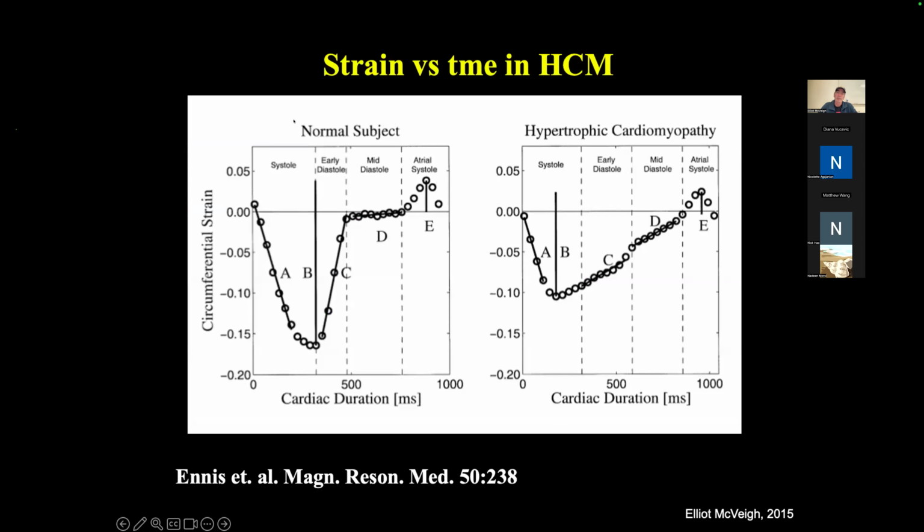This is in a normal person. Okay, so normally when I say normal person, that's one of the grad students jumped in the magnet. The great thing about MR is you just jump in the magnet, right? There's nothing to stop you.